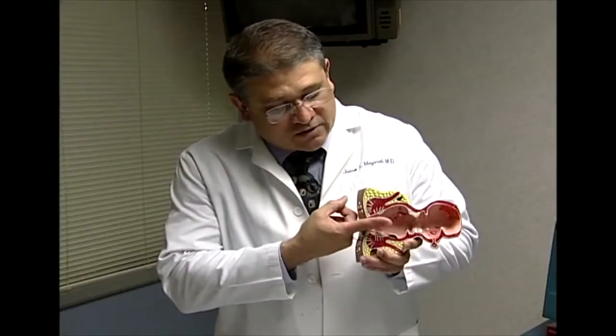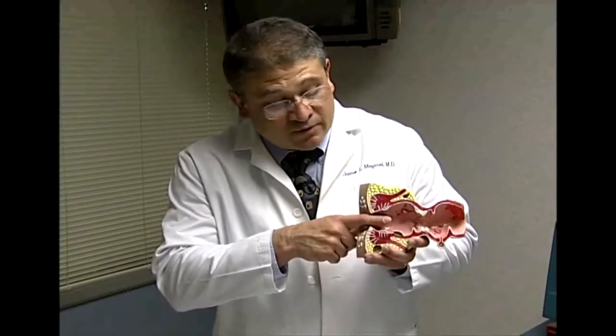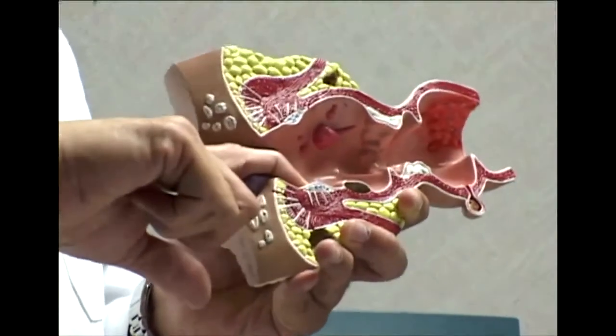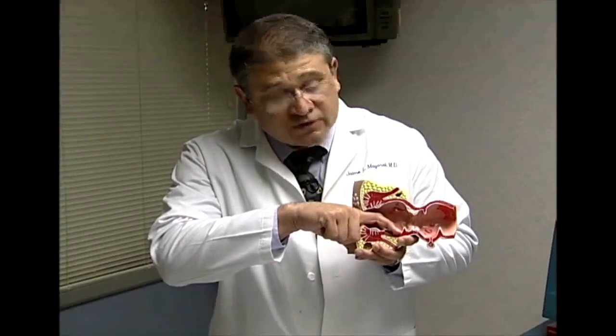I think the biggest mistake physicians make when trying to identify the pudendal nerve is that the finger is not placed correctly all the way into the anus. If it's placed too far distally, it's not going to identify the pudendal nerve. Again, it has to be placed more proximally to identify the pudendal nerve.